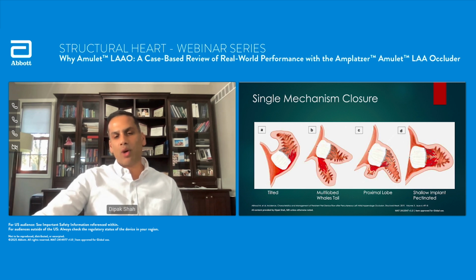These proximal lobes are very challenging for these Watchman devices to handle because you're stuck again. You implant too shallow, you're worried about stability in a shoulder. You implant too deep, this is going to be left uncovered. I'll show you a schematic later on where these anterior pectinates or lobes are left behind.